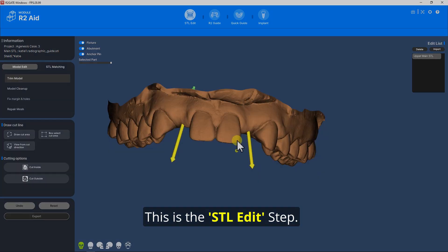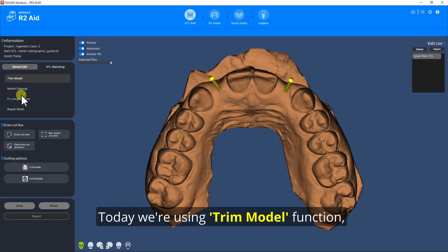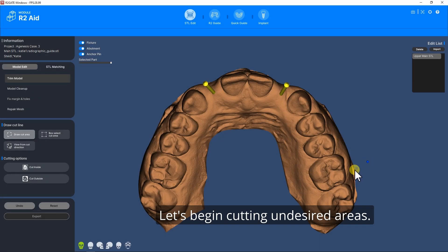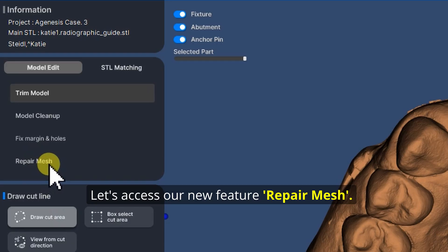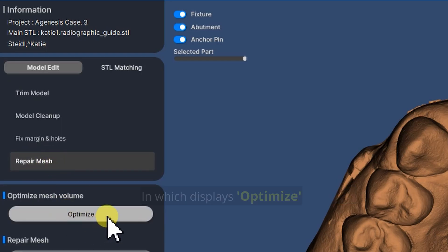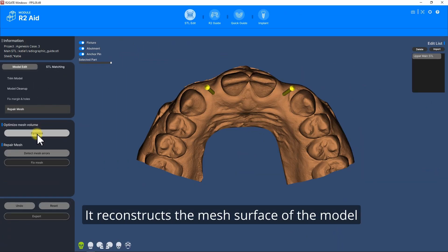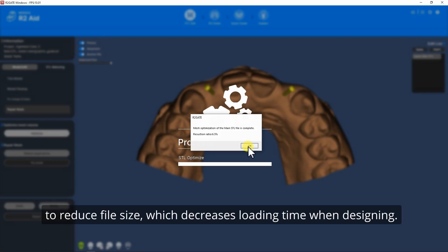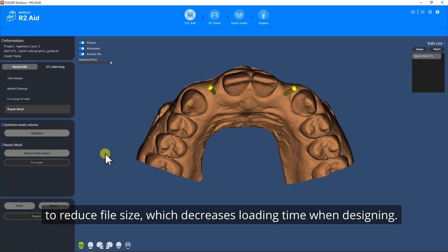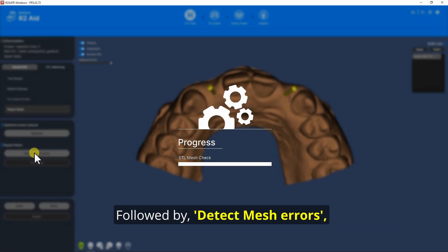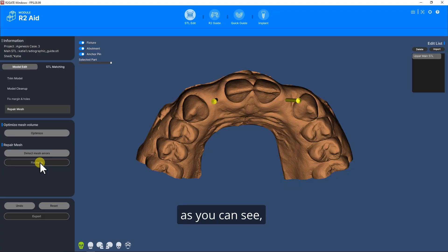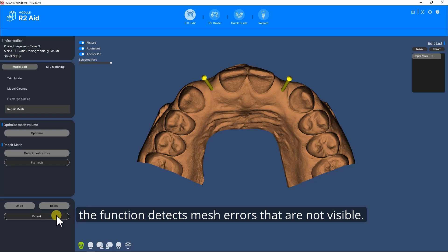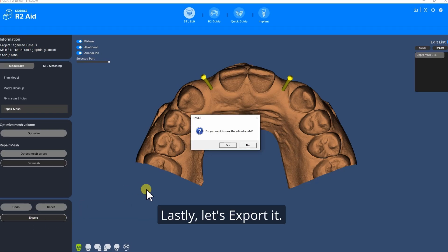This is the STL edit step. Today we're using the Trim Model function. Let's begin cutting undesired areas, followed by Cut Inside. Let's access our new feature Repair Mesh, which displays Optimize. It reconstructs the mesh surface of the model to reduce file size, which decreases loading time when designing. Followed by Detect Mesh Errors, then Fix Mesh. The function detects mesh errors that are not visible. Lastly, let's export it.